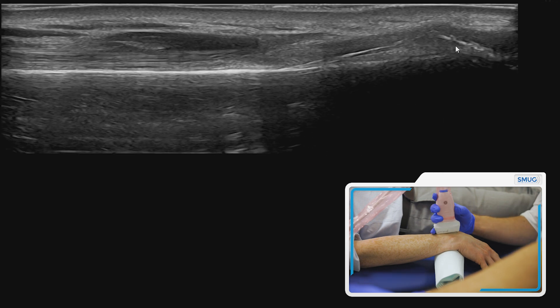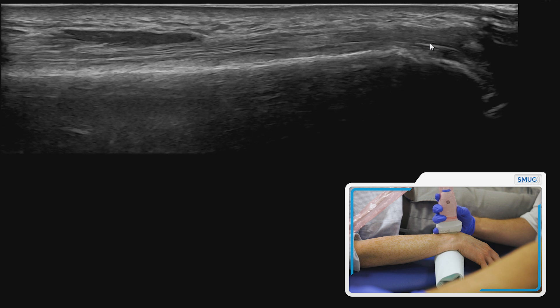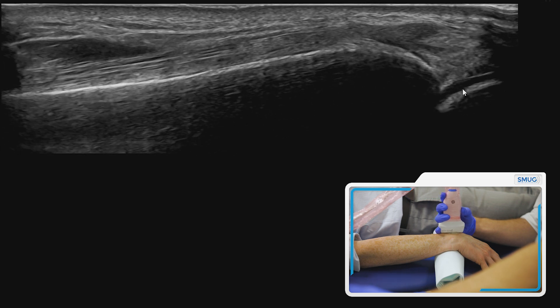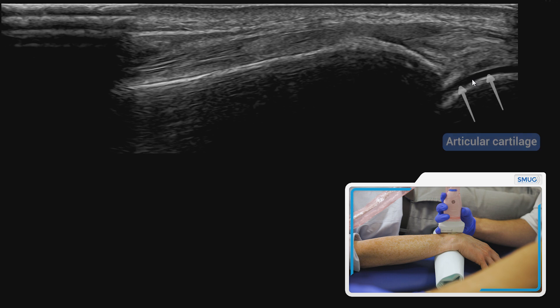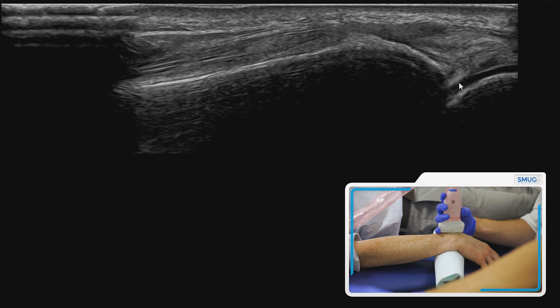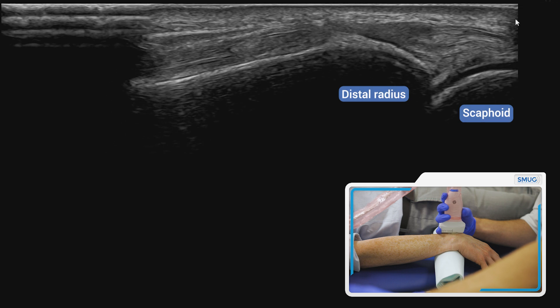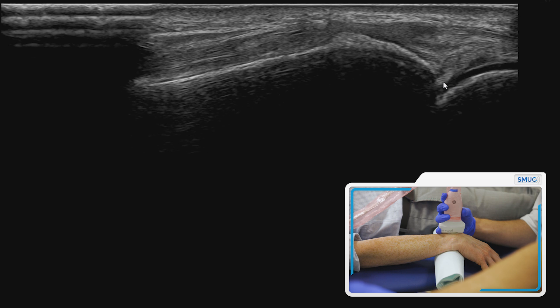You will need a bit of gel for this, and then as you can see there you've got Lister's tubercle. As we slide over, you'll see the articular cartilage — that's the articular cartilage on the first row of the carpus, so that would be the scaphoid bone. This is a really nice image, and this is the radiocarpal joint here.